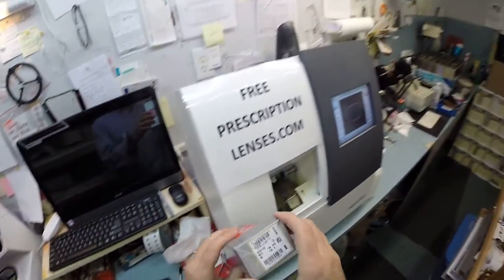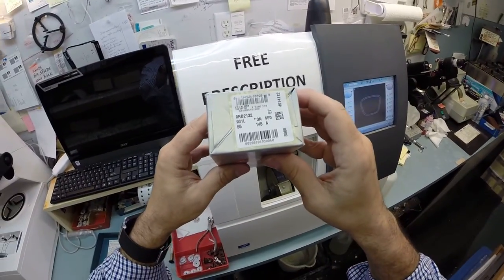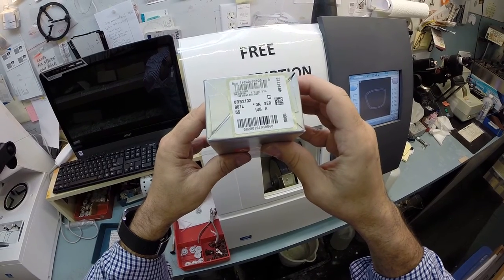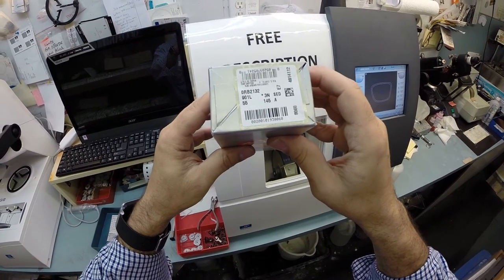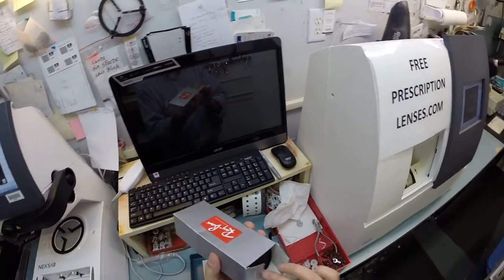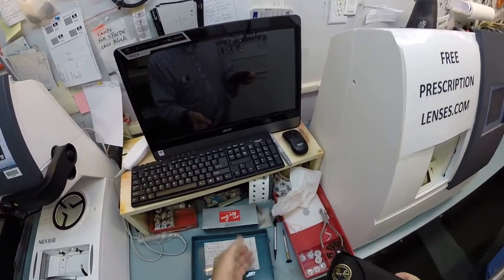With the help of my GoPro camera, I'm going to show you how I cut transition bifocal lenses for your Ray-Ban 2132 New Wayfarer color 901L, which is the classic shiny black and the 55 eye size.